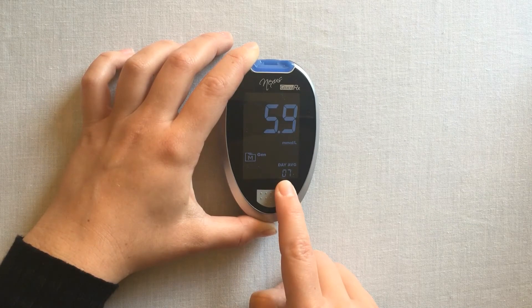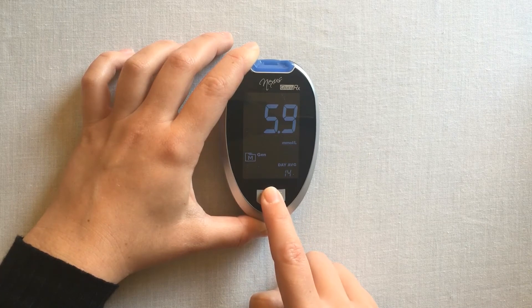Displayed first is your 7 day average. You will then be able to advance through your averages by pressing the main function button. This function will display your 7, 14, 21, 28, 60 and 90 day averages.